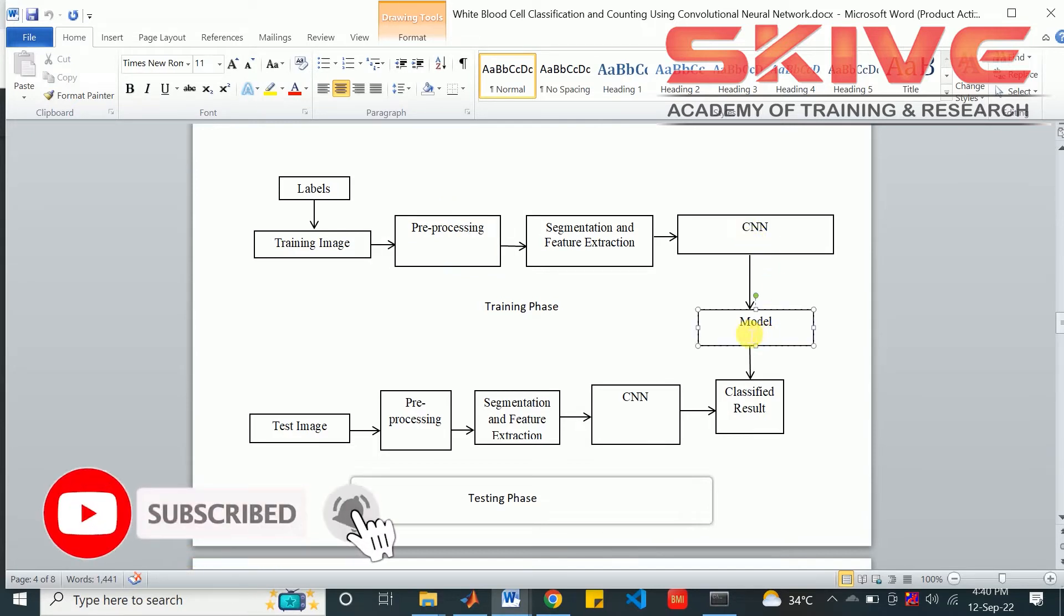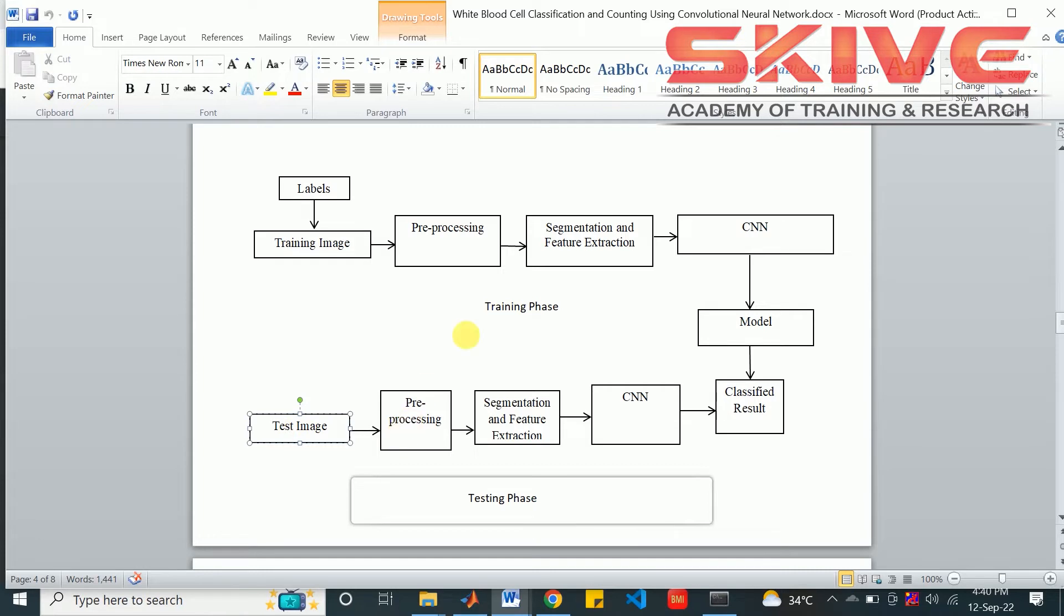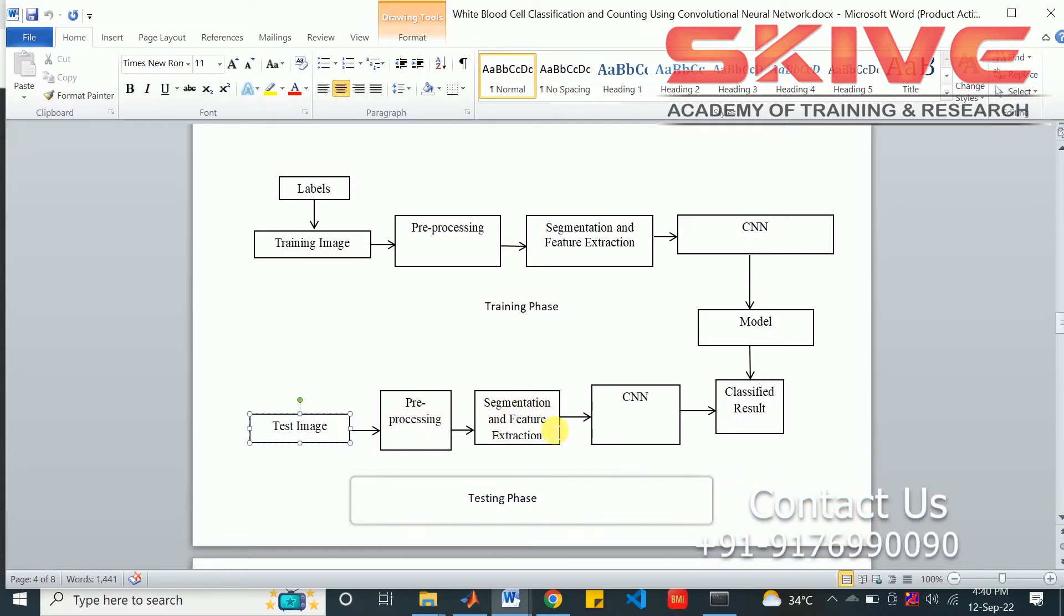In the testing phase we give input image from internet source or any person's blood cell image. We got it from the internet or some hospitals. The test image will be preprocessed as the same process: grayscale conversion and filtering. After these steps, the segmentation of blood cells by using some algorithms in MATLAB.